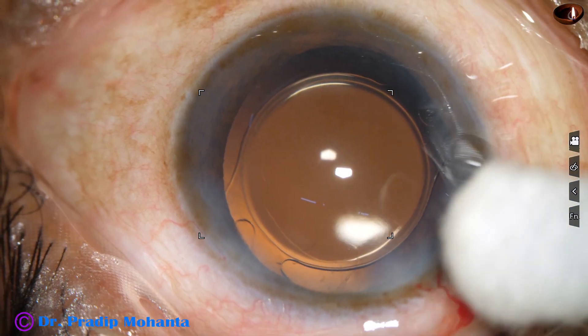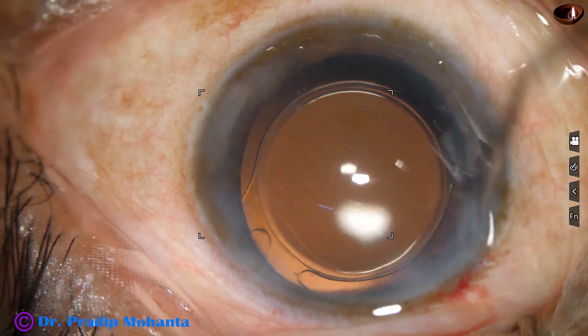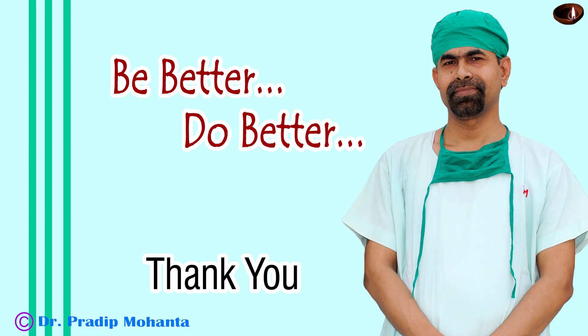The case is concluded with integrity of the wound confirmed. A few drops of moxifloxacin are applied and the case is concluded. Thank you very much for your attention. Hope this video will help you in developing your surgical skills. Be a great surgeon and serve your patients with love, respect, empathy, and great surgical competence.